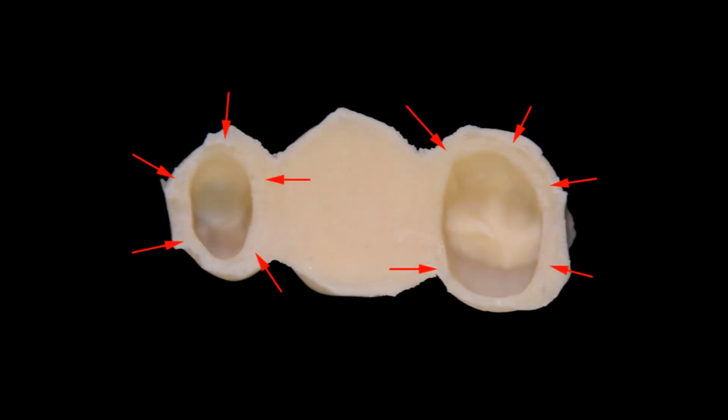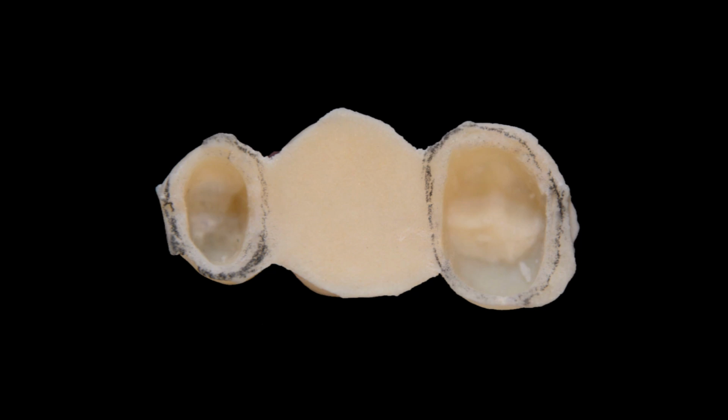After the material has set, it is removed from the cast and examined for overextensions and excesses in material. Identifying the finish line extension is important so as to remove any overextensions that may injure the oral mucosa. The outer limit of the finish line is marked with a pencil, and anything external to it should be removed.